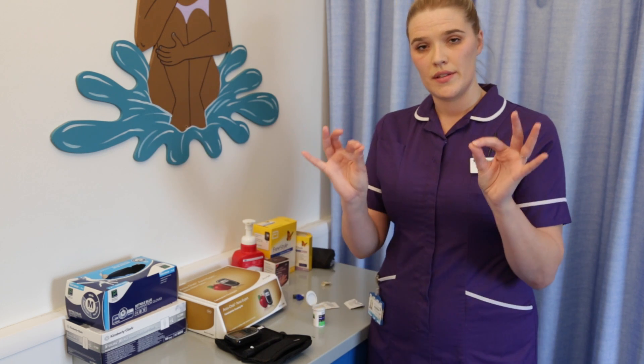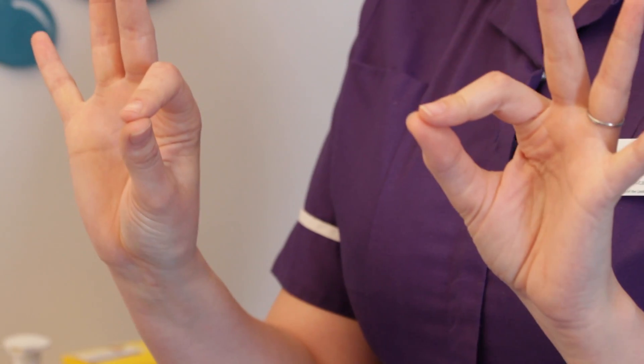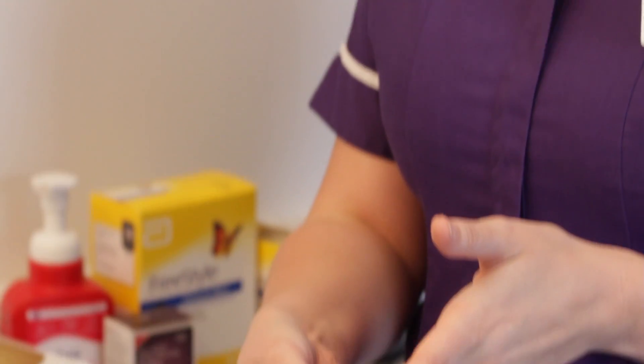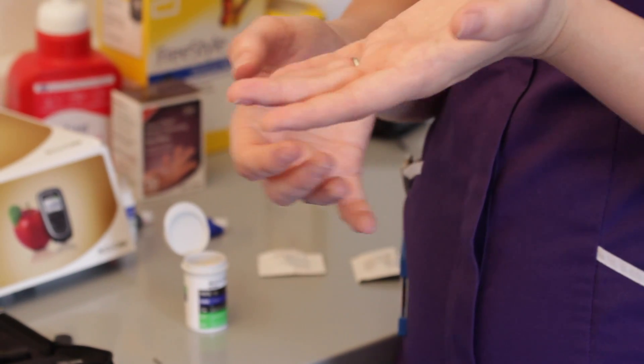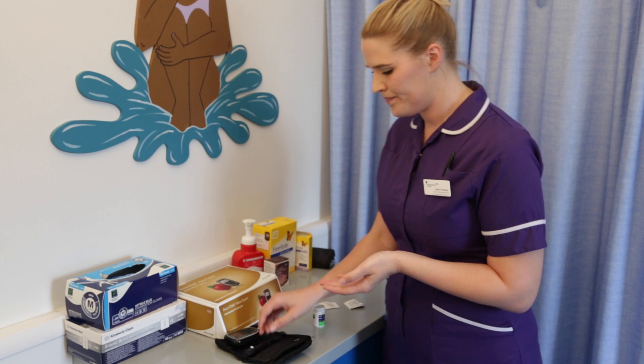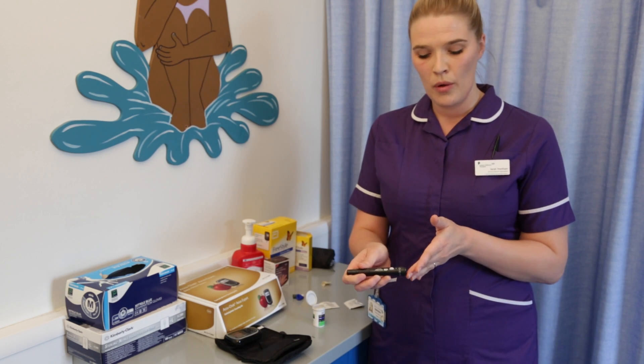We try not to use the thumb and forefinger, so these three fingers on both hands, and we try and use the sides of the fingers. We always avoid the pads and the tips because that's where the nerve endings are and it will be painful. With your finger pricker, line the hole up with the side of the finger and press.